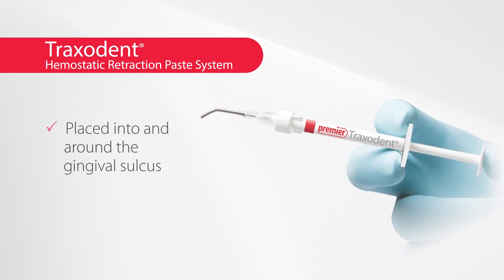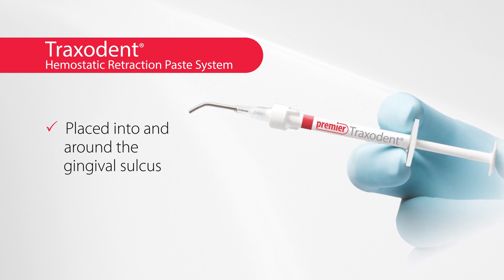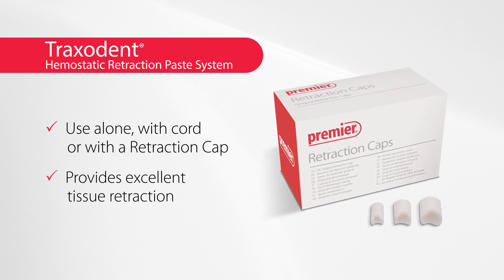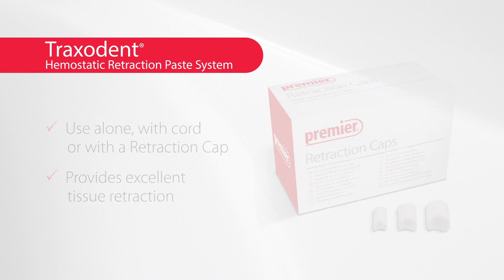Traxedent is designed to be placed into and around the gingival sulcus and within several minutes produce hemostasis and drying. When used with a retraction cap — essentially a cylindrical dense cotton pellet — and direct pressure, Traxedent can also provide excellent tissue retraction.